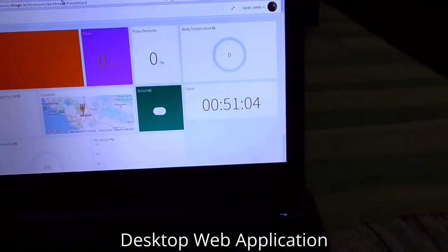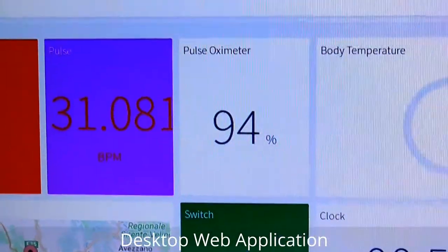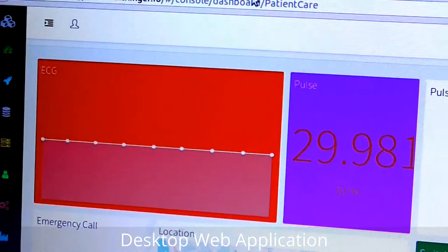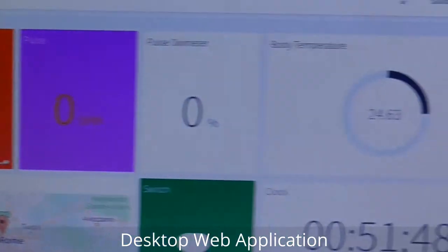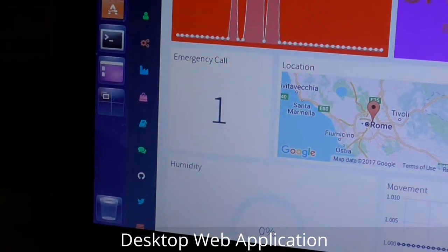Now the pulse and pulse oximeter are showing — let me place my finger on the sensor. You can see the pulse and the pulse oximeter — BPM and the oxygen level. Body temperature shows 24-point-something. This is the ECG — you can see the curve is changing. The temperature is also changing as I try to adjust it.